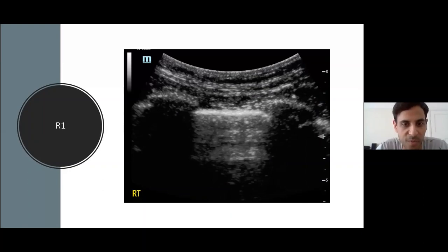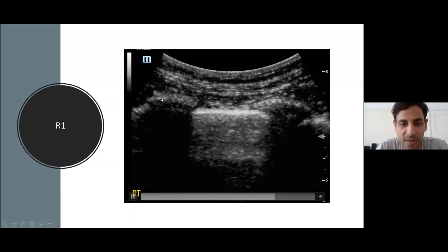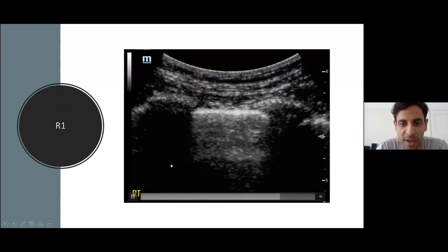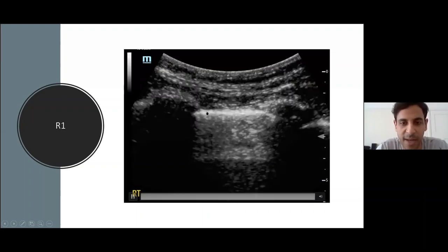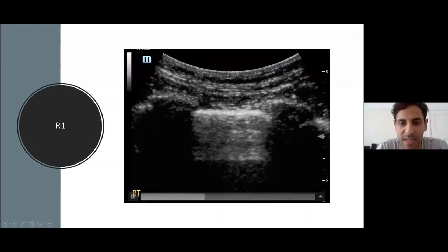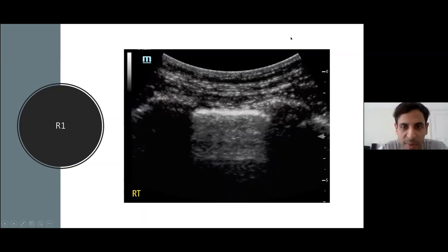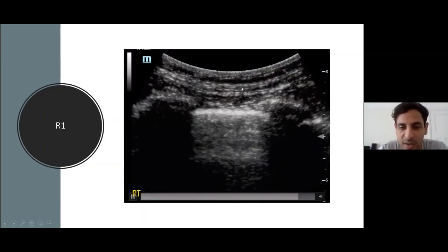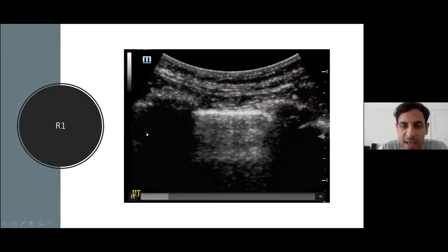We proceeded to do point-of-care lung ultrasound, starting with the right side. R1 — anterior superior — shows a typical normal view: bat wing sign, ribs with rib shadows, subcutaneous tissue, intercostal muscle, and a bright white pleural line. As the patient breathes in and out, the pleura slides — consistent with normal appearances, ruling out pneumothorax. Just below it we see an A-line, a normal reverberation artifact. R2, just inferiorly, shows much the same: normal rib shadows, sliding pleura, and A-lines — all consistent with normal lung.